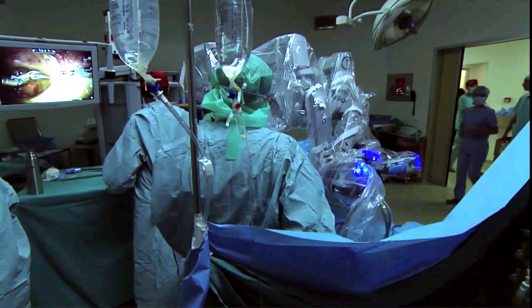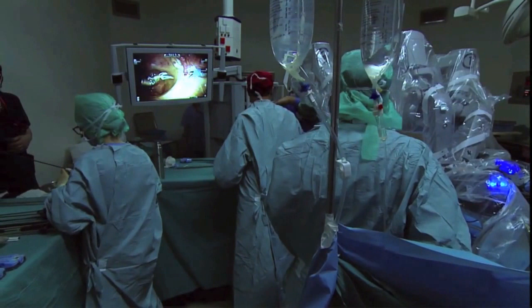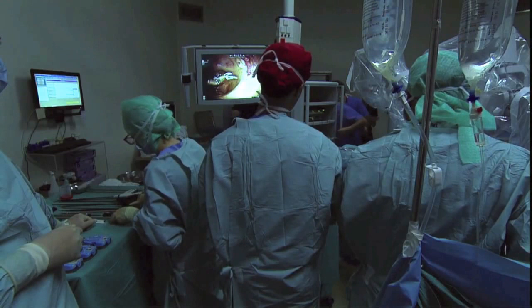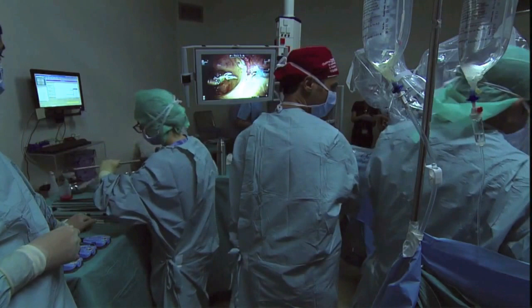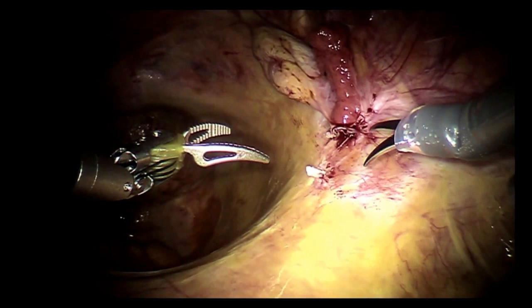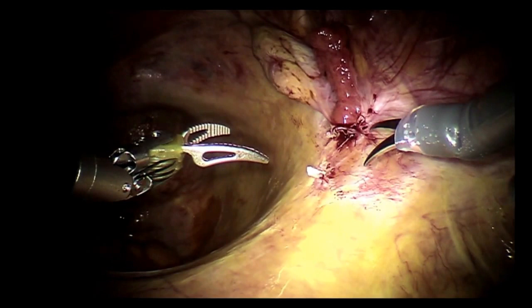Also, we are going to do the back table dissection and prepare the kidney on ice before, of course, bringing it into the recipient. We have a specific jacket that we have created from lap sponges that allows us to put ice around the kidney and put the whole thing in the jacket, thereby maintaining hypothermia during the entire operating time.